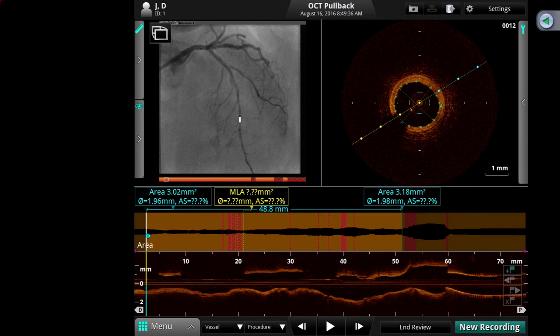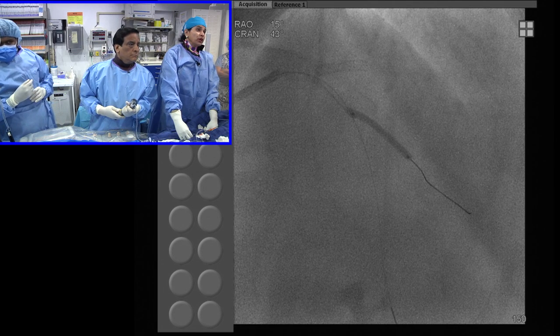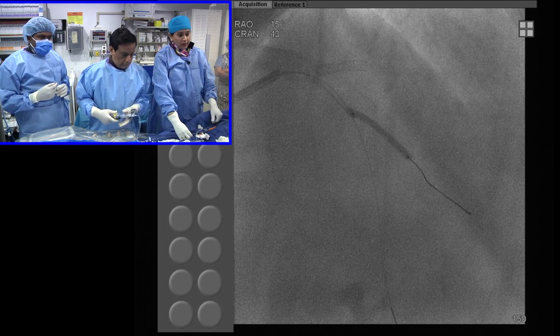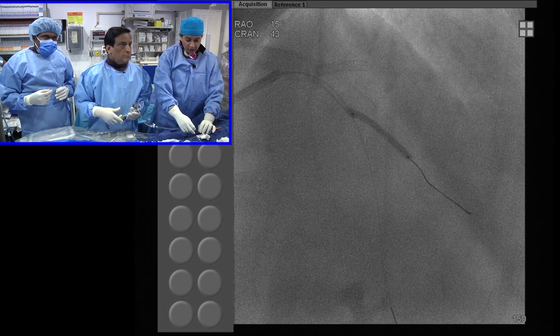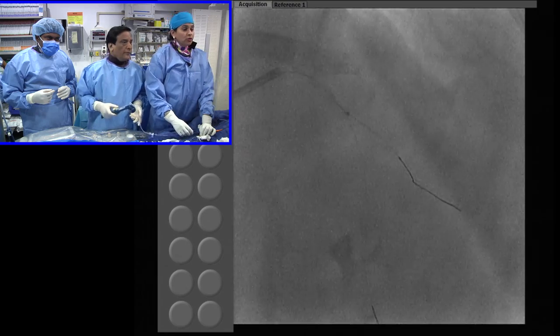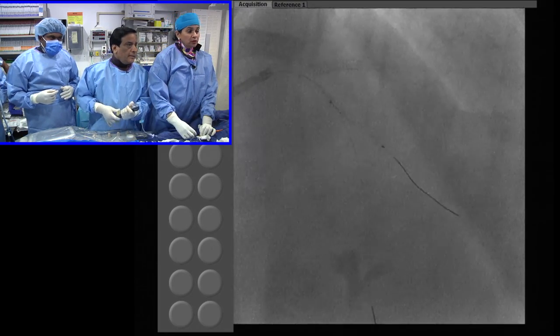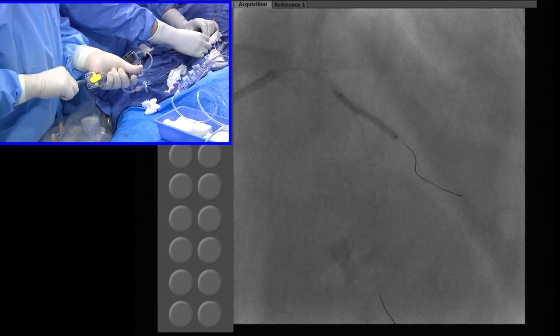No, angiographically, I think you would use a 2.75 stent there. Distally you will put a 2.5 stent, proximally you will put a 2.75 stent, and you just do the same thing. But they don't come with 2.75, so then you have to make a decision, 2.5 or 3.0. Yeah, 2.5 maybe distally and proximally 3.0. We need two 2.5 stents there. Yeah, good. Distally 2.5? Yeah, distally 2.5.